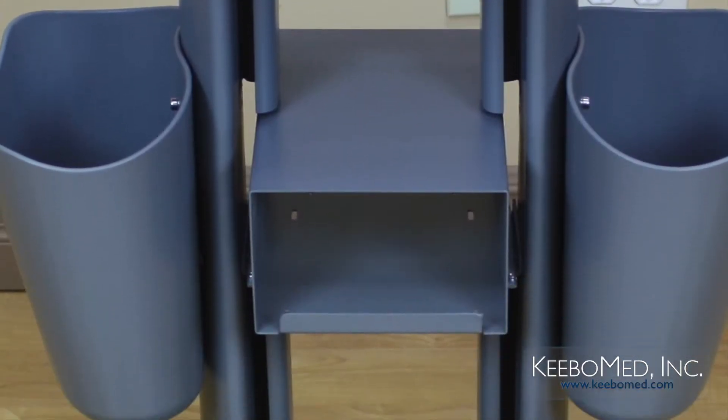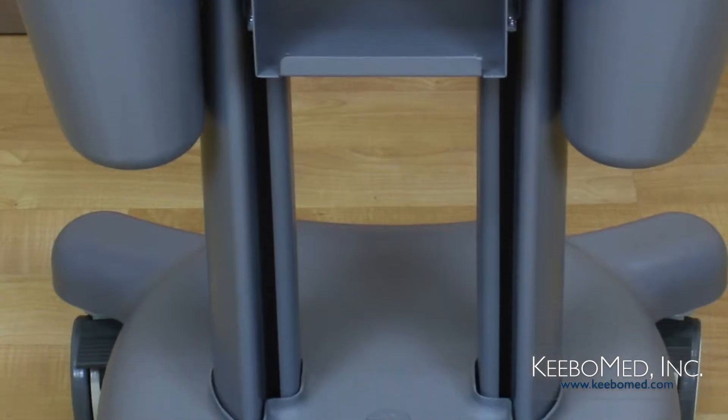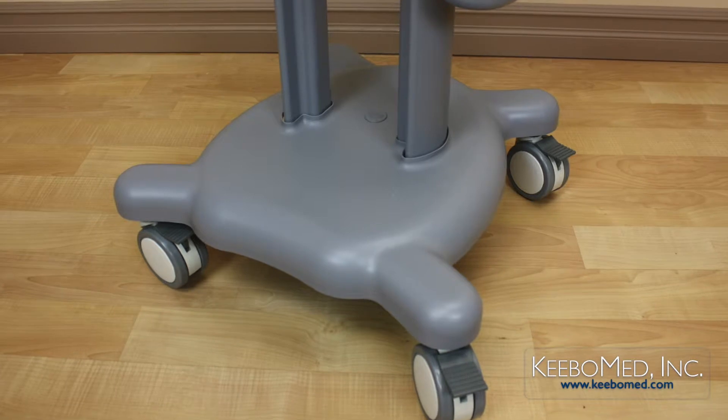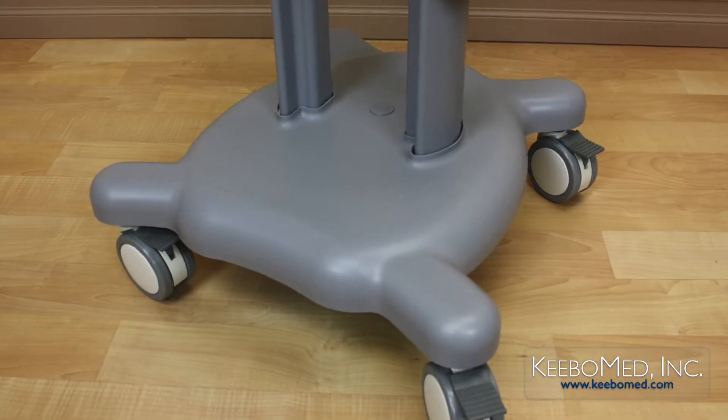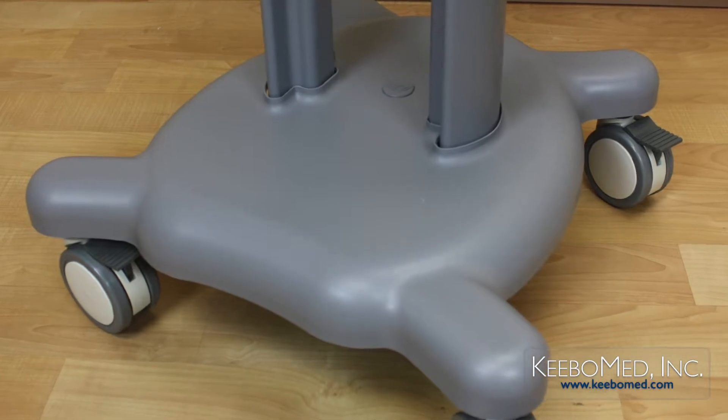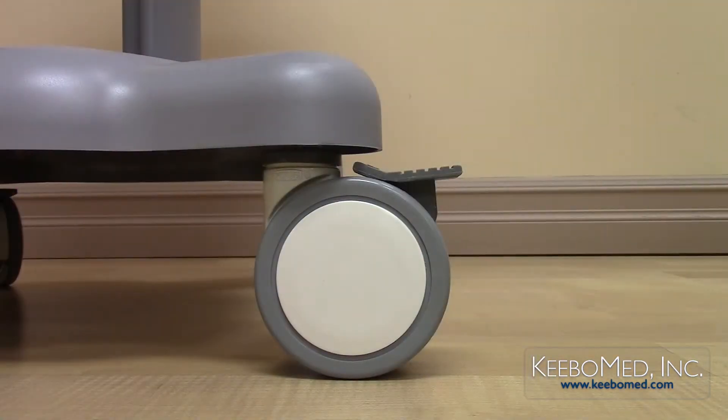The side supports feature cord channels to keep cords neat and organized. The base is strong, keeping the cart well balanced. Four wheels at the bottom allow the trolley to be easily moved and have the ability to be locked in place.